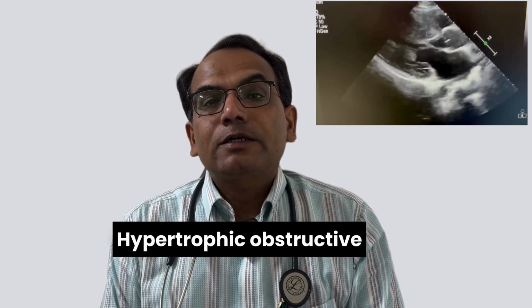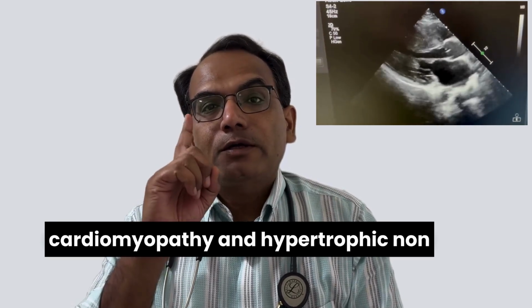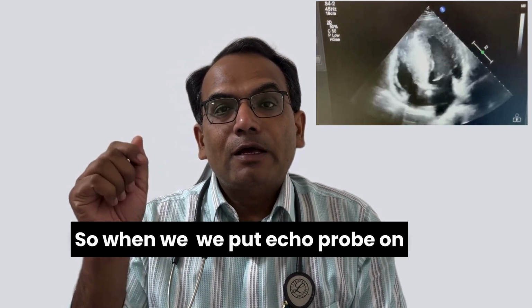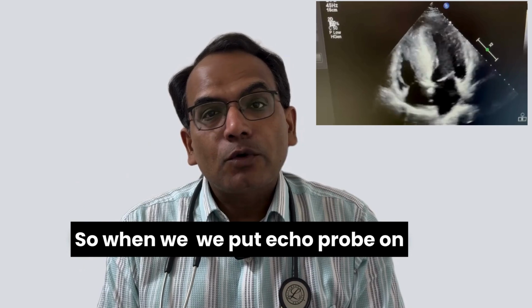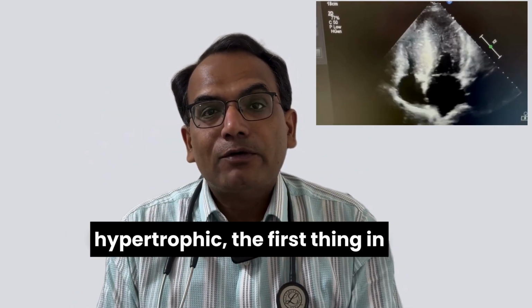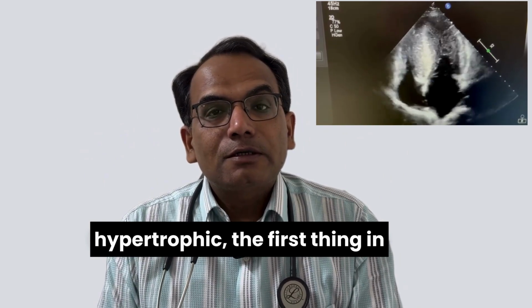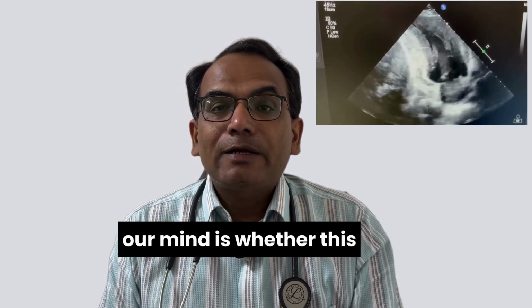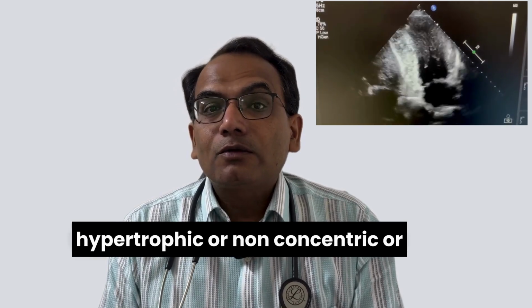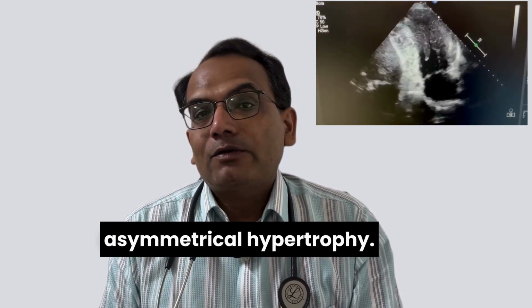Hypertrophic obstructive cardiomyopathy and hypertrophic non-obstructive cardiomyopathy. So when we put the echo probe on a patient and see that the left ventricle is hypertrophic, the first thing in our mind is whether this hypertrophy is concentric or non-concentric, asymmetrical hypertrophy.